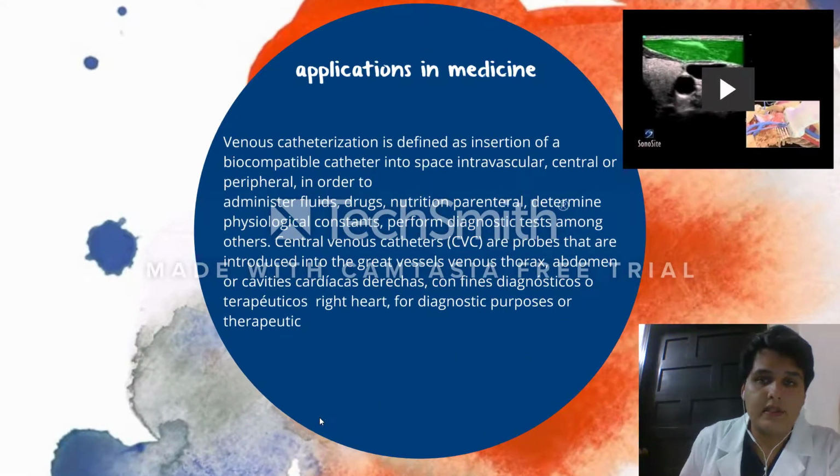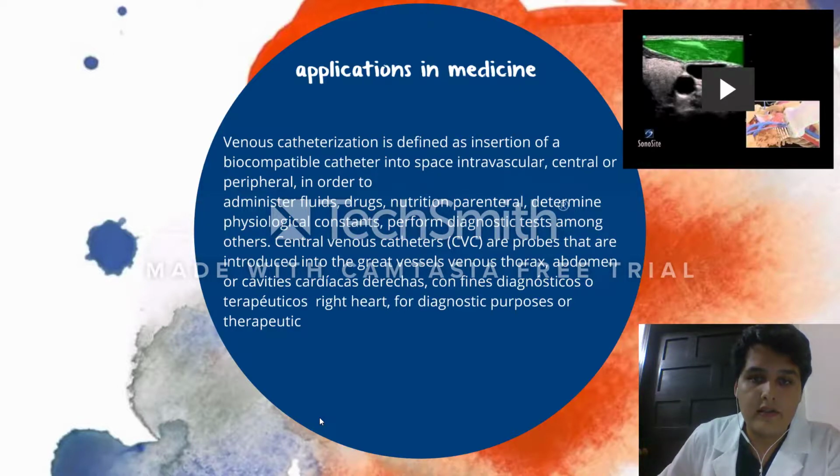In medicine, venous catheterization is defined as the insertion of a biocompatible catheter into the intravascular space, central or peripheral, in order to administer fluids, drugs, parenteral nutrition, determine physiological constants, perform diagnostic tests, among others.